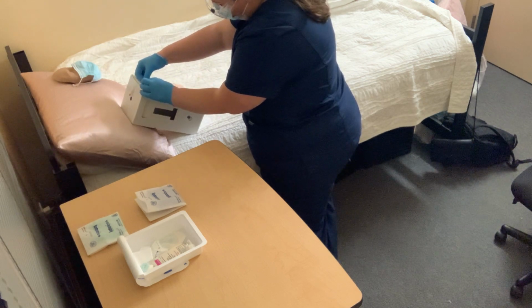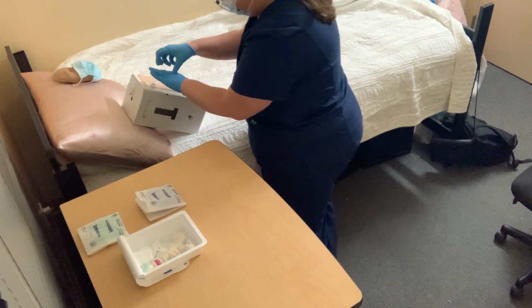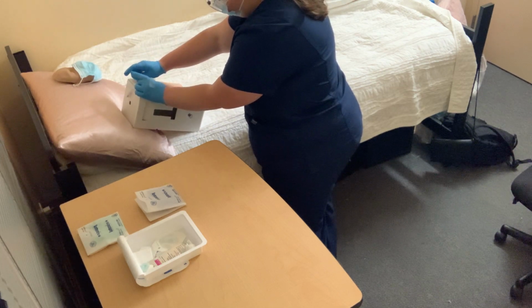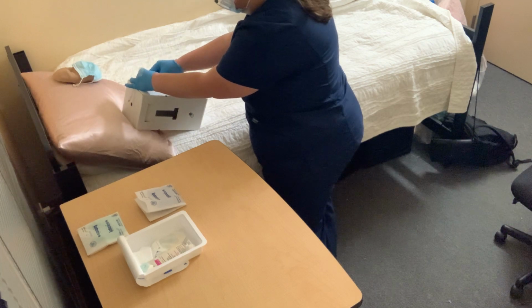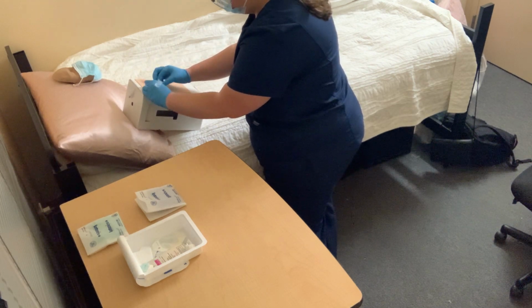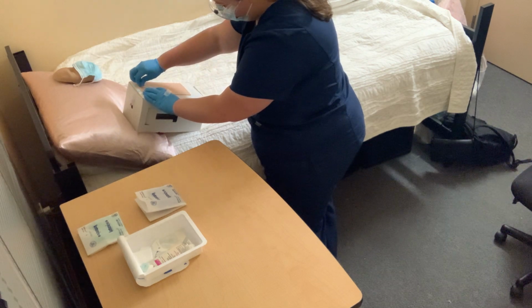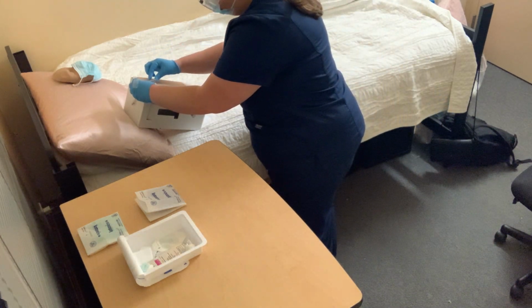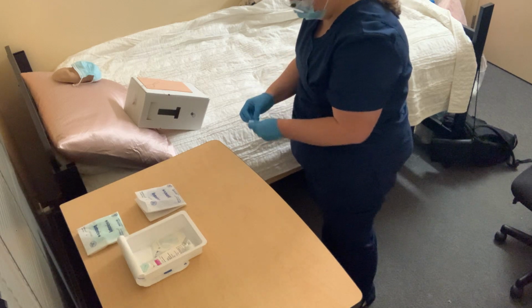So I'm going to start by removing the taping that has secured the tubing. And then I'm going to start removing the tegaderm itself. Making sure to be gentle on the patient and not press on the insertion site. And as I get closer to the insertion site, I'm just making sure to stabilize the tubing with my left hand. And then I'm going to remove the bio patch. Are you doing all right, Mr. Smith? All right.